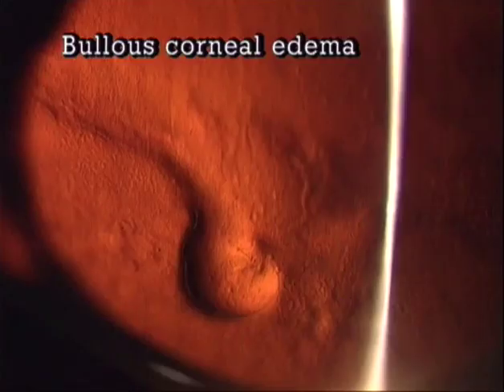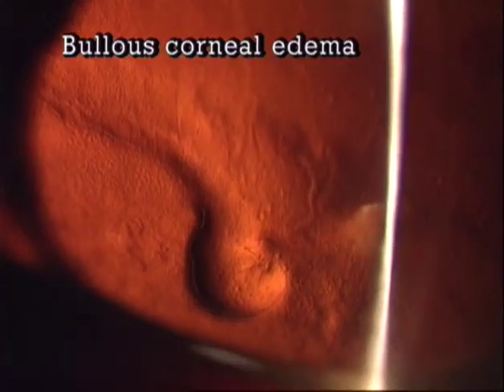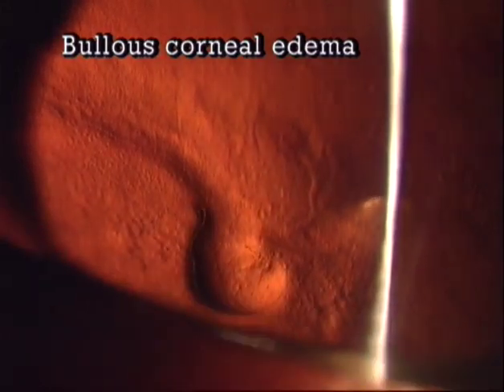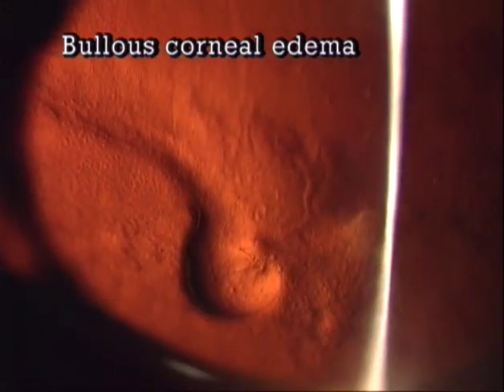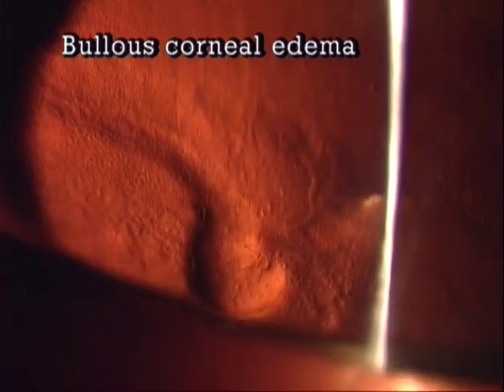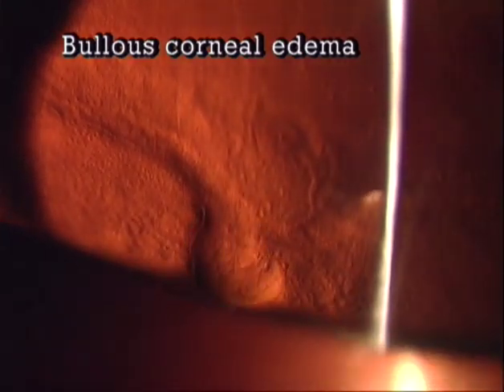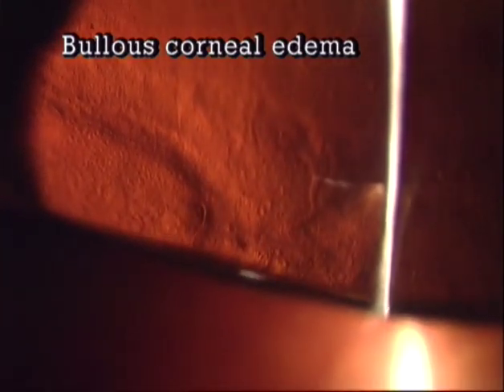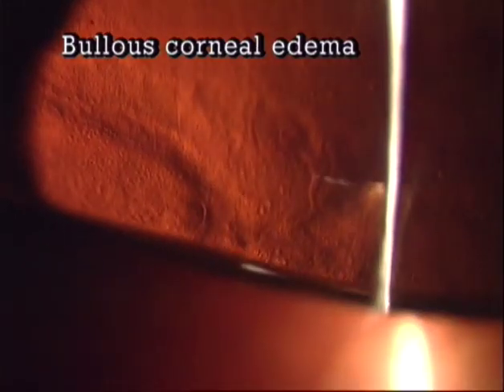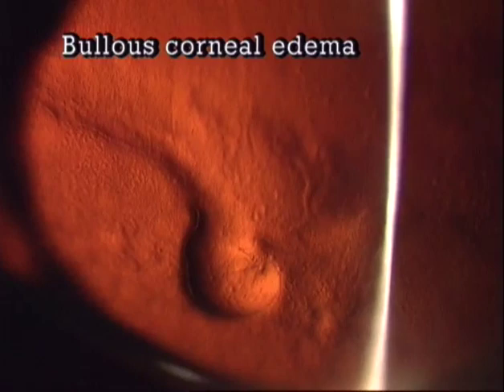The appearance of a refraction phenomenon depends upon the curvature of the refracting object. This is shown here by the example of a flaccid bullous detachment of the corneal epithelium, seen against the red backlight from the fundus. When the fluid within the bubble is shifted, the curvature of the bubble varies and so does the refraction phenomenon. Further, the appearance of the refraction phenomenon depends upon the color and the shape of the backlight.